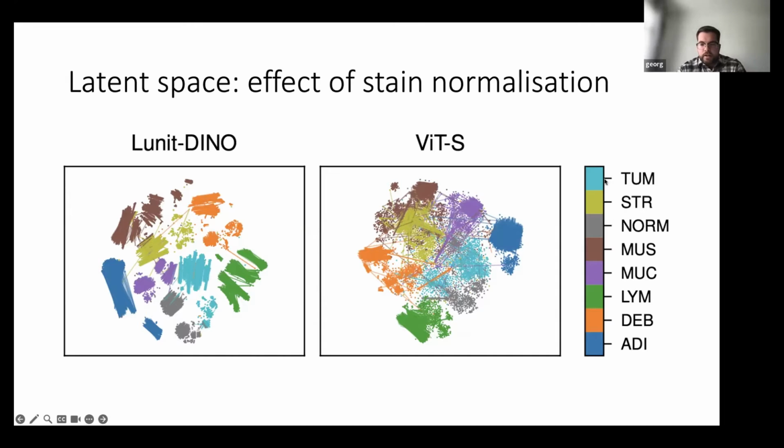So right here, we're visualizing different tissue classes, so tumor, stroma. Every patch is classified as tumor, stroma, or whatever. And most of these jumps are within the clusters. So these lines are kind of staying within their clusters. But on the right, you see that they jump between clusters. So normal tissue might jump into the tumor tissue category.